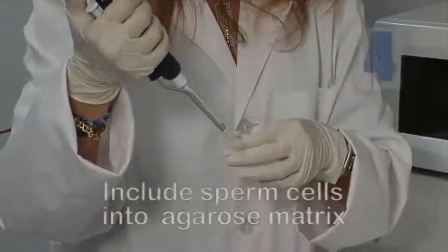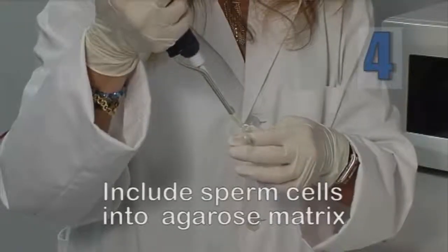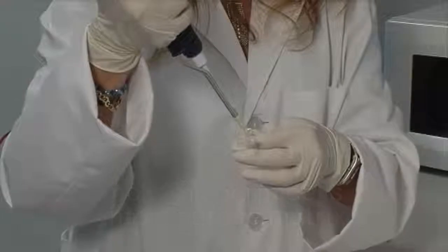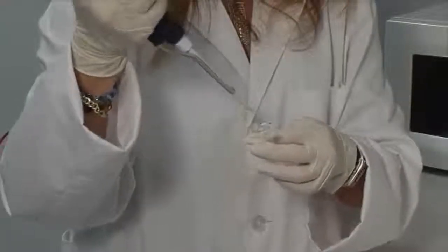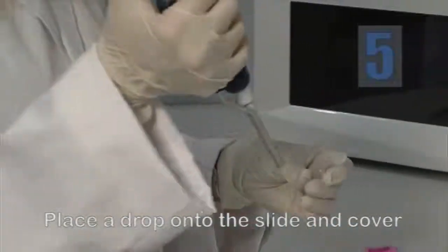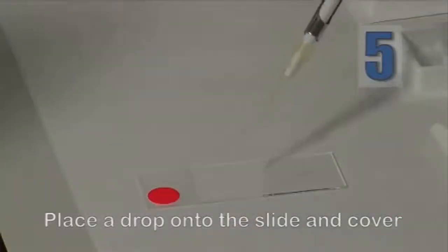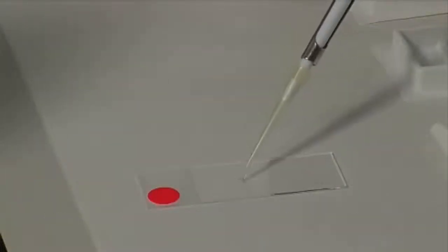Add 25 microliters of diluted semen to the liquefied agarose and homogenize. Place a 15 microliter drop of the mixture onto the pre-treated side of the slide and cover with a coverslip.